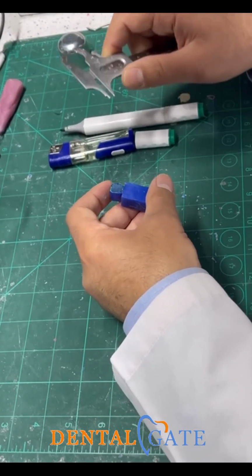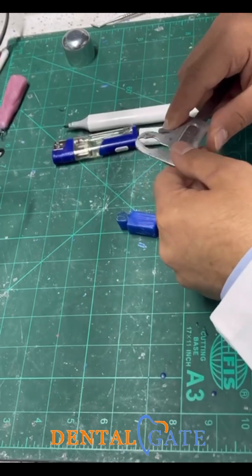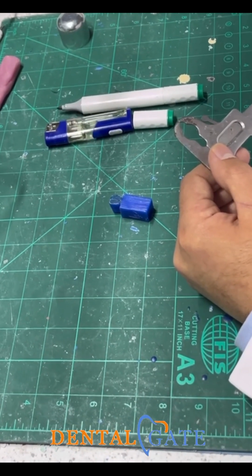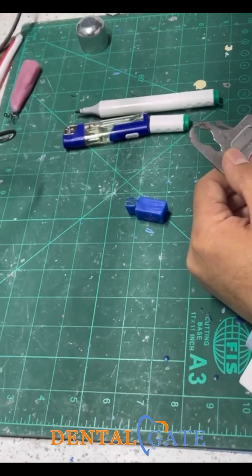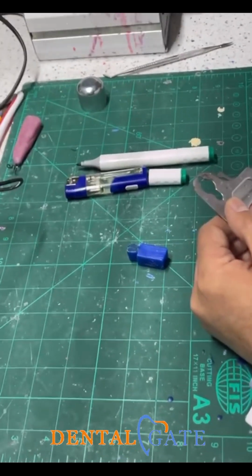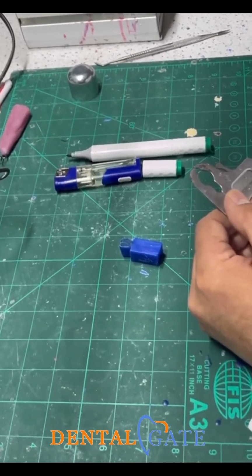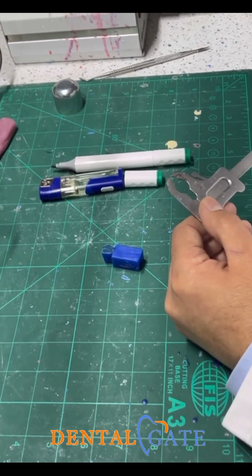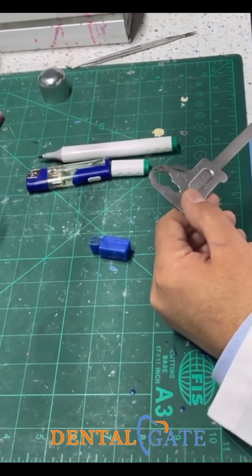And be sure there is 10.5 for the length of the crown. So we need 10 millimeters, or 10.5 is not a problem, not a big deal. This 0.5 I will increase, not decrease.